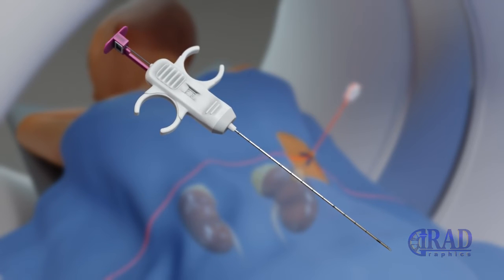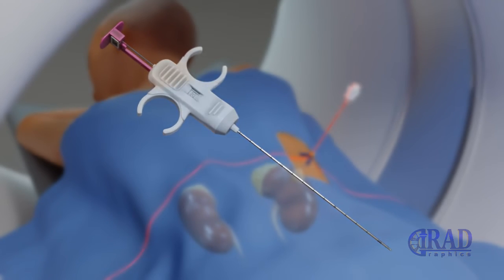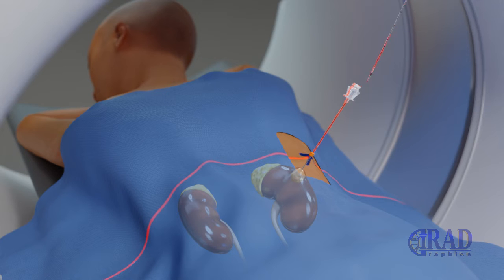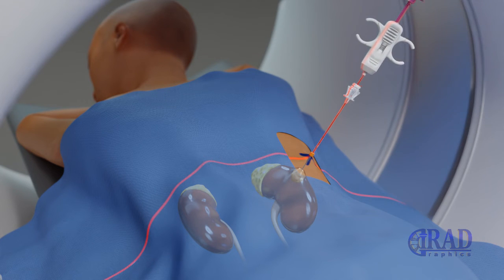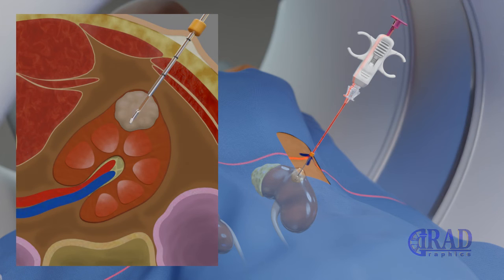The biopsy device is prepared and then advanced through the biopsy cannula into the lesion. Subsequently, multiple passes are performed to obtain the required tissue samples.